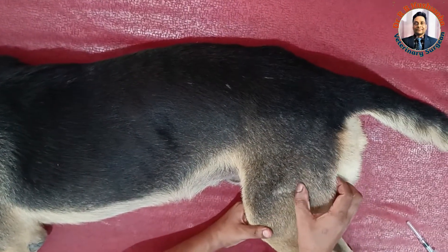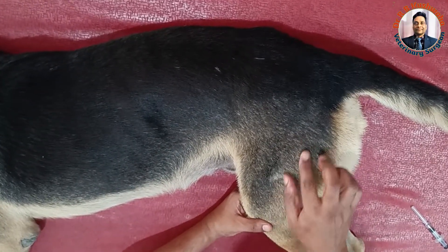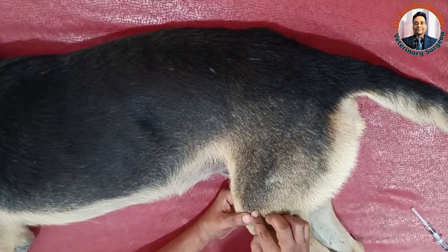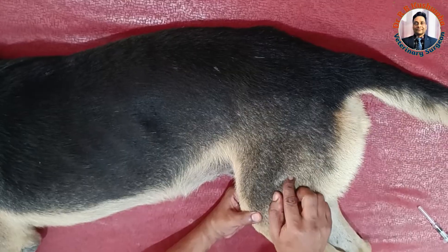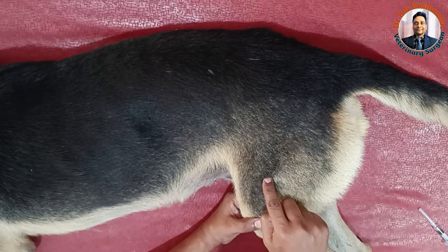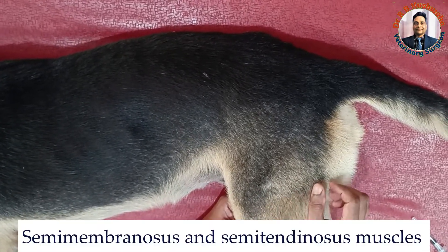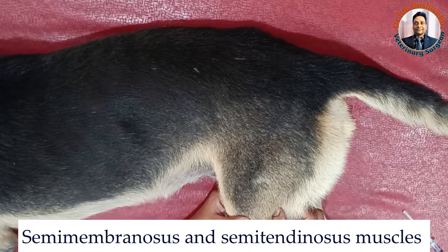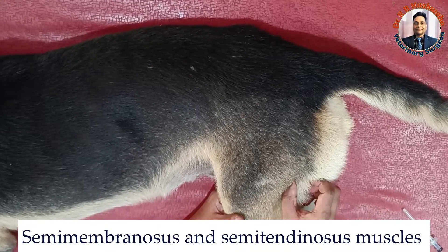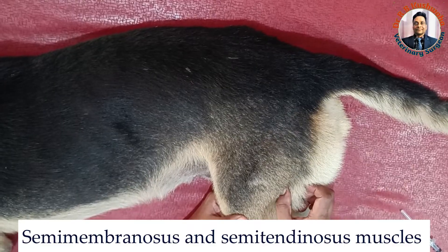To give the injection in the caudal thigh area, you need to remember the anatomy. This is the femur bone — this is the greater trochanter, this is the shaft of the femur, and this is the distal end of the femur bone. Cranial to this bone is the vastus lateralis muscle, and caudal to it are the biceps femoris, semimembranosus, and semitendinosus muscles. These muscles are basically the sites for the intramuscular injection.